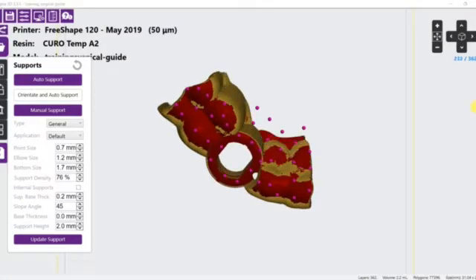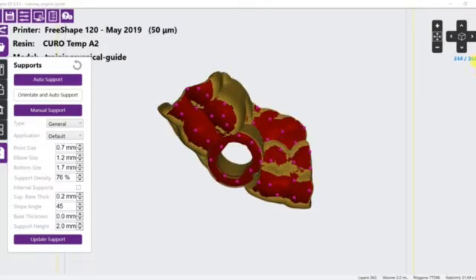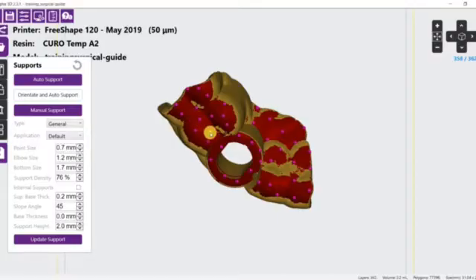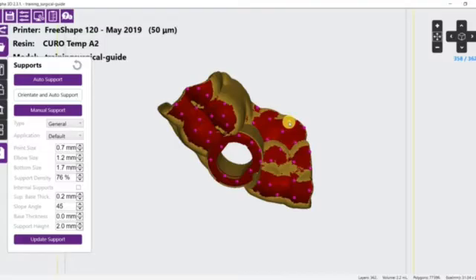Second situation, there is not enough support density in this area. There must be enough supports to hold the part and make sure that it will not fall.